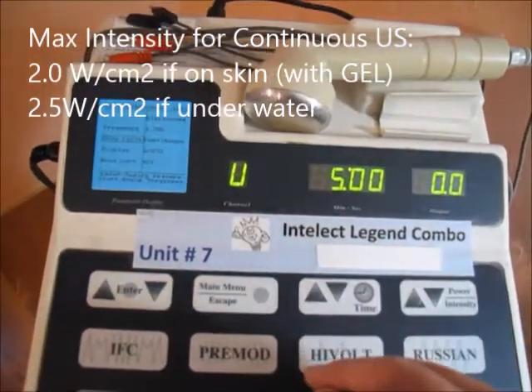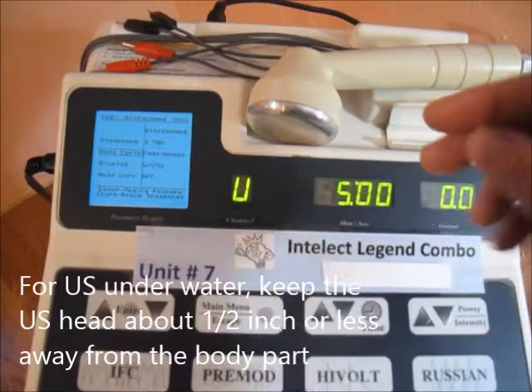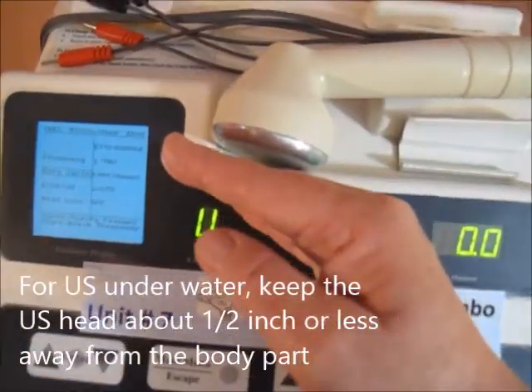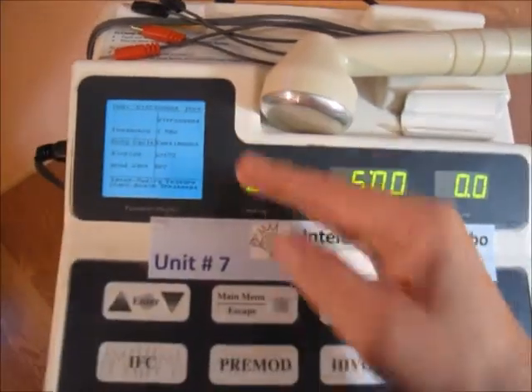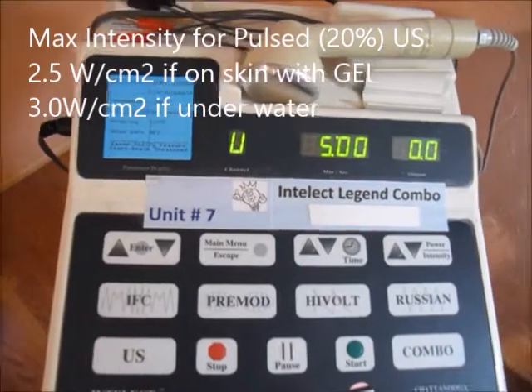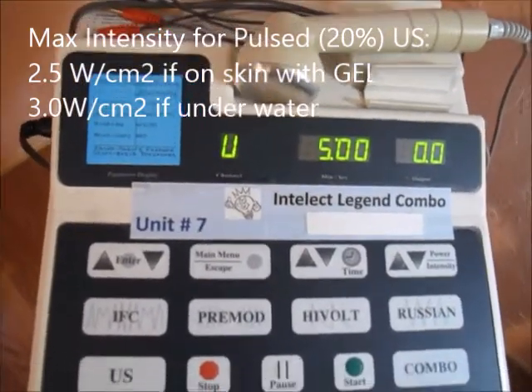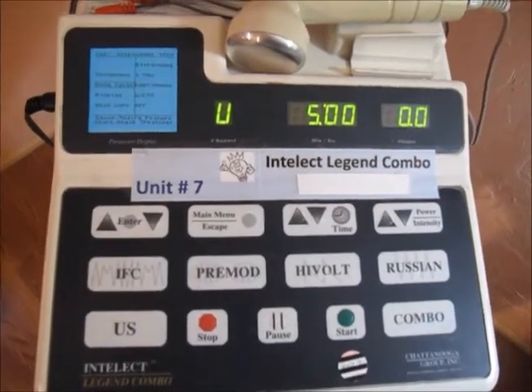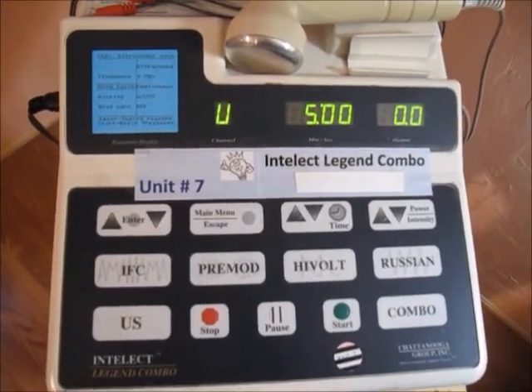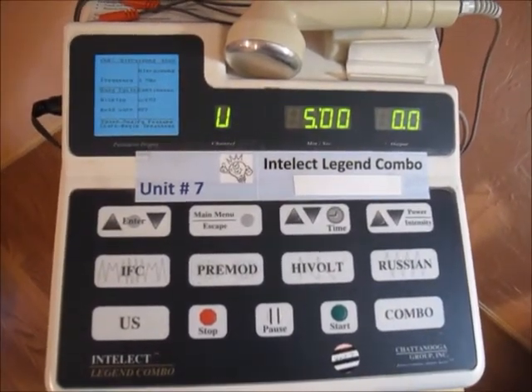It's 2.5 watts per centimeter squared if the ultrasound head is underwater and next to the body part. When you do it underwater, you will hold it about a half inch or less apart. If you're using pulsed ultrasound, you can use between 2.5 and up to 3 watts per centimeter squared. There is some question about whether pulsed ultrasound causes thermal changes, but most studies have been done at 2.5 watts per centimeter squared.